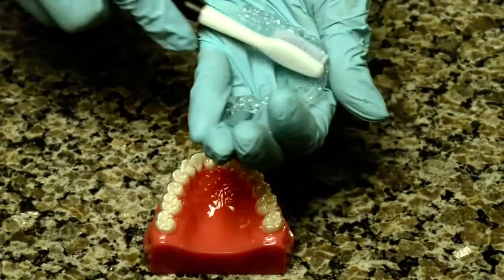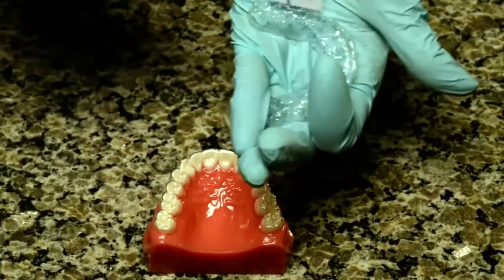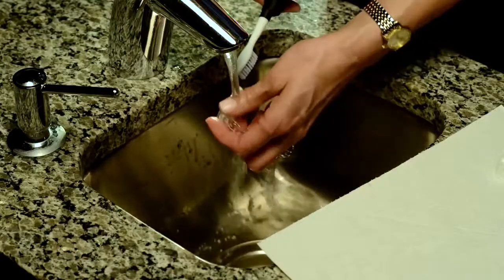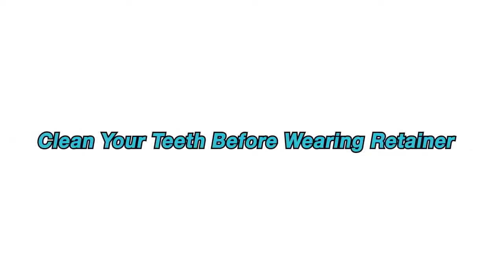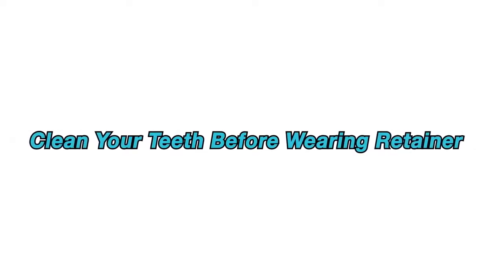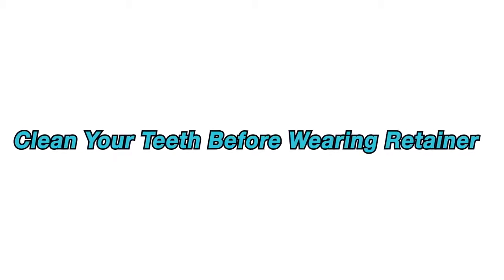The Essix retainer should be cleaned each morning when you take it out of your mouth using a toothbrush and toothpaste. Place the retainer flat in the palm of your hand and brush it. Turn it over and brush it again. Then rinse it in water before placing it into your case. It is also very important to have clean teeth before inserting your retainer, as plaque on your teeth can also build up on your retainer.